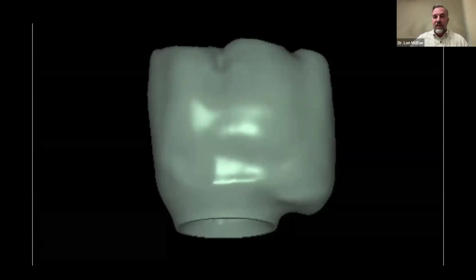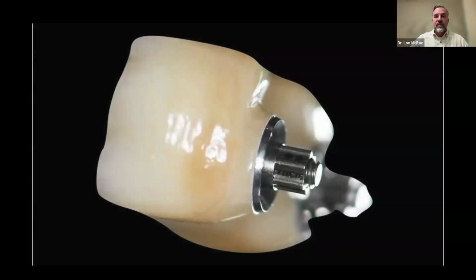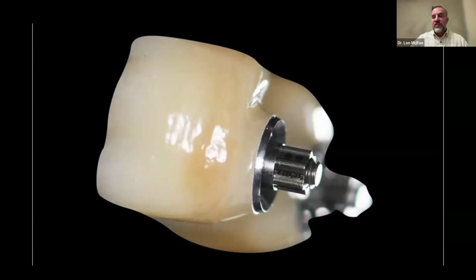They had to do a little ovate pontic, a mini ovate pontic on there. I actually think that the lab did a phenomenal job with the way that they made that. If they would have just come completely out, it would have been more of a bacteria trap. And so aesthetically, they did a phenomenal job in being able to make this crown. They matched the adjacent teeth beautifully. So this is beautiful work by the lab.